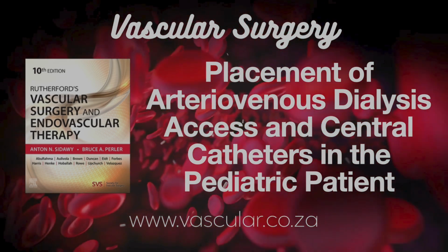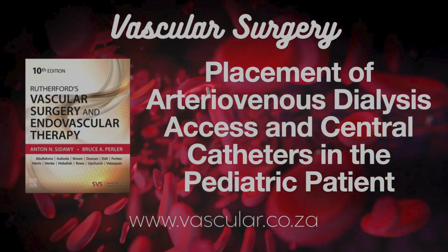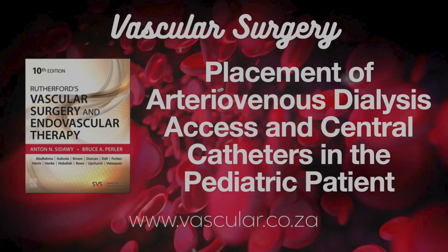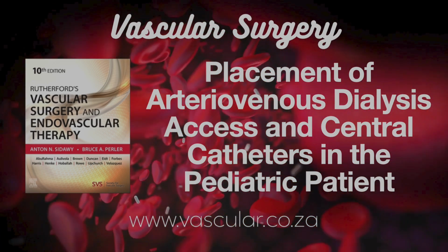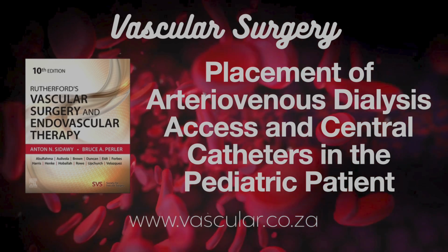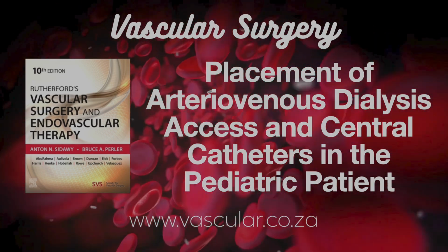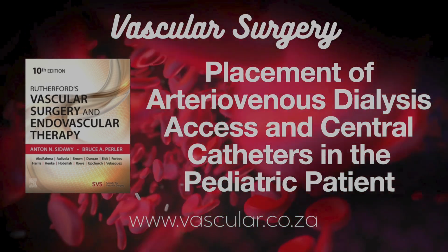But the downsides seem pretty significant. Shorter lifespan than fistulas. Oh, definitely. Often less than a year, sometimes just months. Failure rates are high, infections a big one, 17 to 40%. Clotting, thrombosis, maybe a third fail that way. Sometimes they just get pulled out accidentally or kink. And the big long-term worry is that central venous stenosis, especially with subclavian placement. Exactly. Rates cited are anywhere from 25 to 50% after subclavian CVCs.